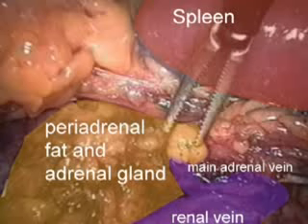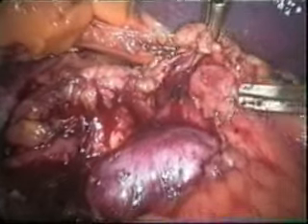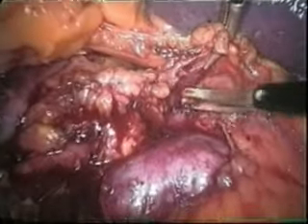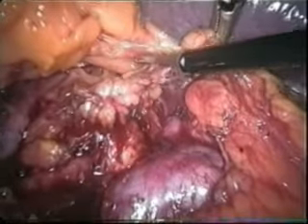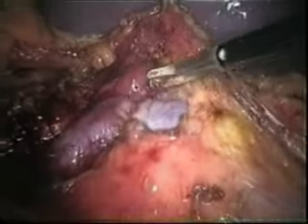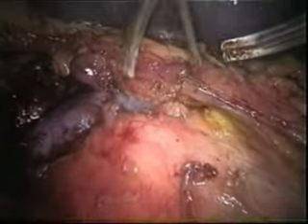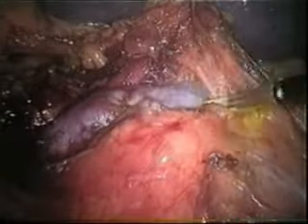The renal vein marks the lower boundary of resection, and the main adrenal vein has to be fully exposed to at least 5 mm to guarantee safe positioning of clips. Now all fatty tissue around the renal vein is mobilized and incised to expose the main adrenal vein. Occasional careful blunt dissection may be helpful in this part of the procedure. Great care has to be taken to identify adrenal veins as early as possible.